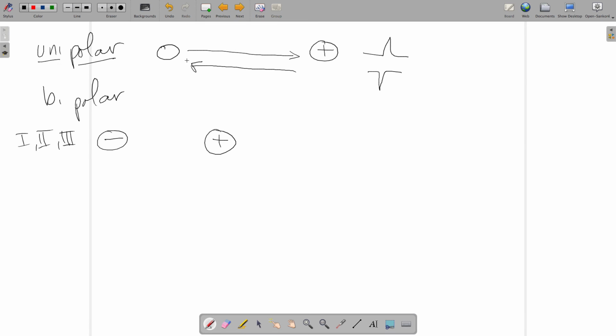So unipolar leads are all of the other leads. I'm going to hesitantly put the AV leads here because they're kind of unipolar, but they're a little bit modified. And then V1 through V6, these are all definitively unipolar. All of your chest leads, by the way, voltage 1, voltage 2, voltage 3, nothing too fancy here. The V leads go across the chest. These guys are all positive and they're all unipolar. And then leads 1, 2, and 3 are bipolar leads in the system.